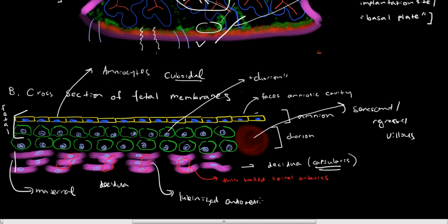So if you say, well, if that's endometrial stroma, can you see the glands? And the answer is, if you're very careful and you look really carefully, sometimes you could actually see the endometrial glands. But I've left them out because they're not crucial. But what I do want to point your attention to is what you do see when you look in the decidua capsularis: these thin-walled vessels. And they're so thin-walled you won't recognize them for what they are.